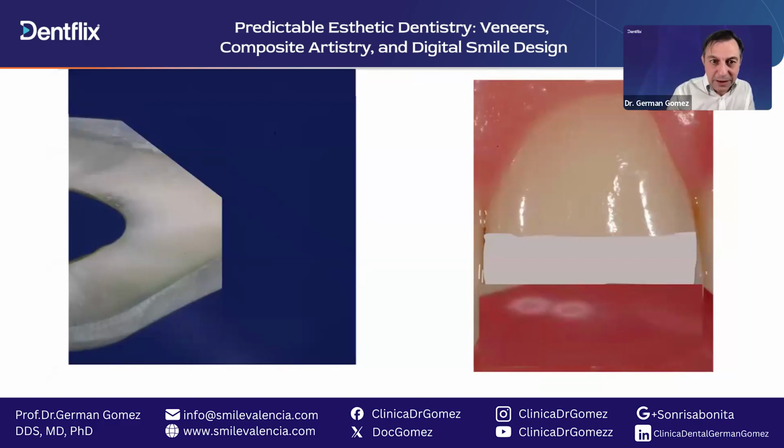So that's the first bevel now. It's beveled here, so this line is here, and this line is now deeper here. Now how do we handle this line? We cover it with dentin shade and then enamel shade, so we make it invisible.